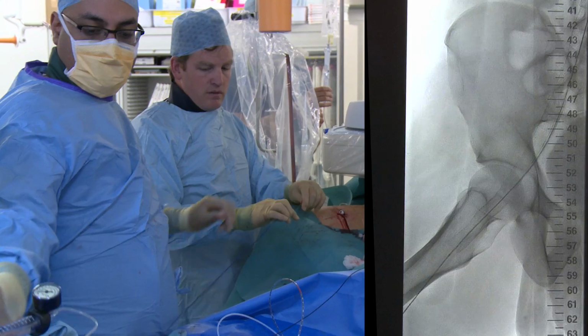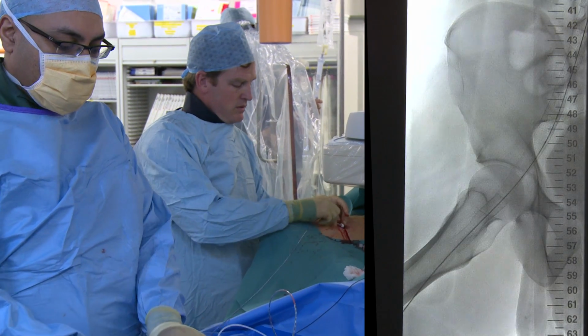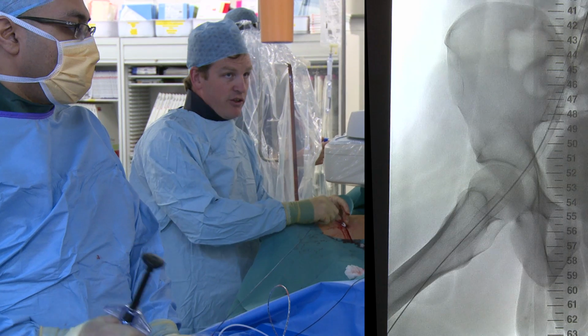The entire length of the treated area is post-dilated from central end to peripheral end.